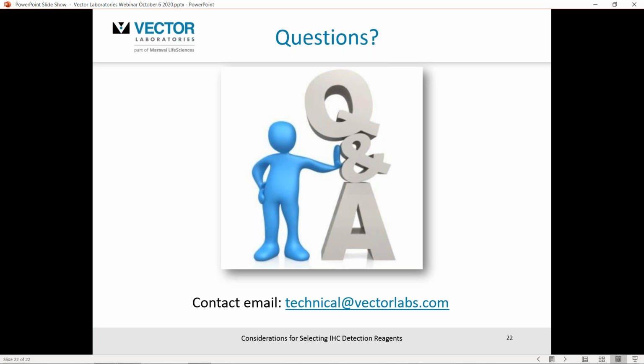Great, thank you, Craig. The next question, how should I select a Vector Stain ABC kit versus a polymer system? Yeah, these are parallel detection methodologies. The ABC system certainly has a track record of being widely used in many applications, whereby it exploits the high affinity of avidin and biotin.